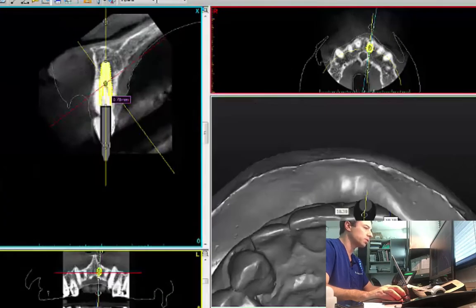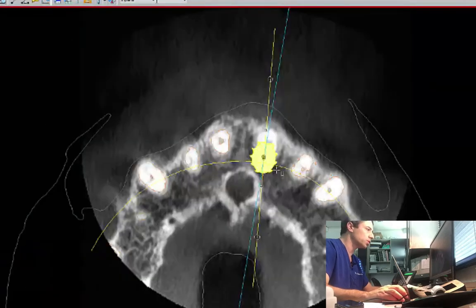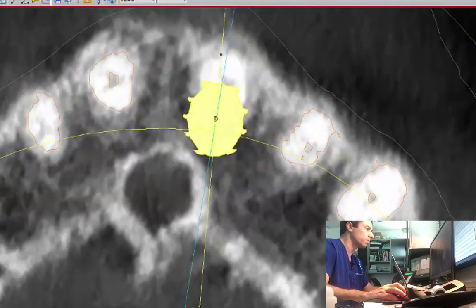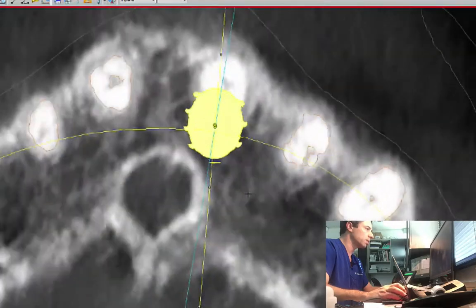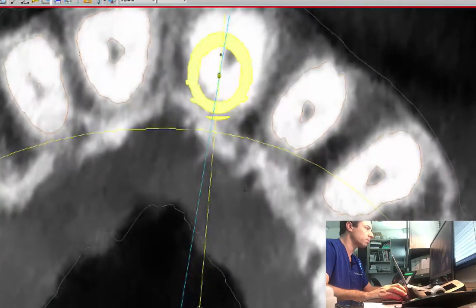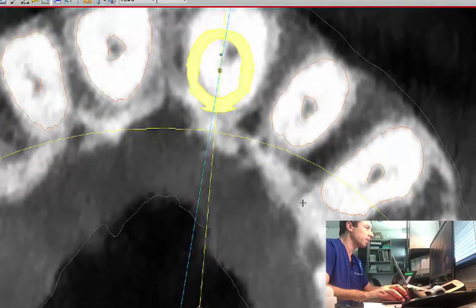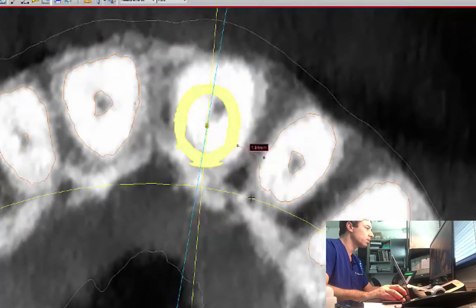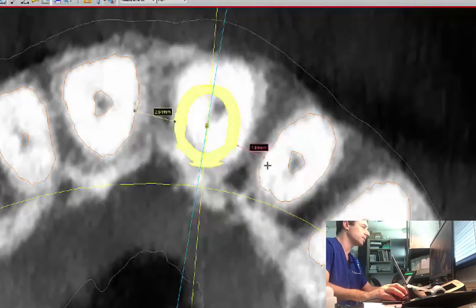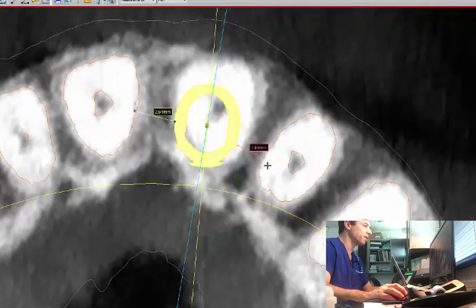Let me just look at the space between the roots, if you don't mind, just so we make sure. So here is the distance in the platform. Here's the platform of the implant. We have some room here. We have more room to the central. Would you feel comfortable if I move this implant bodily a little bit to the mesial? Or is that going to be too much?